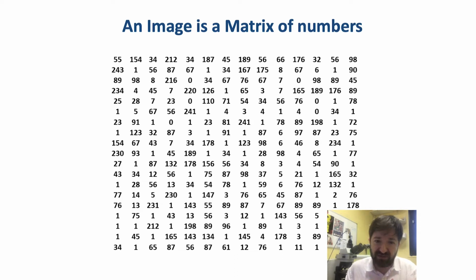But maybe more importantly, it will change the way we review and we study the slides, because when you have this digital file, you have a very large picture, and you have to remember that an image, a photograph, every image is a matrix of numbers. Each number is the value of the pixel, and there are also spatial coordinates for each pixel.